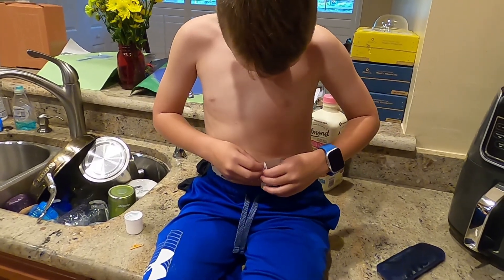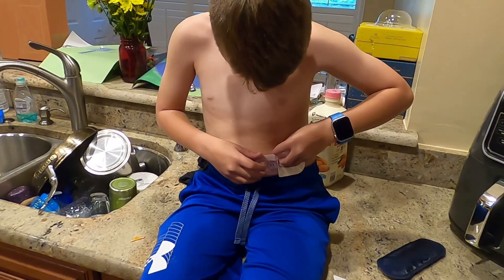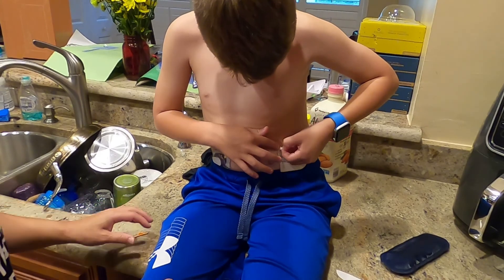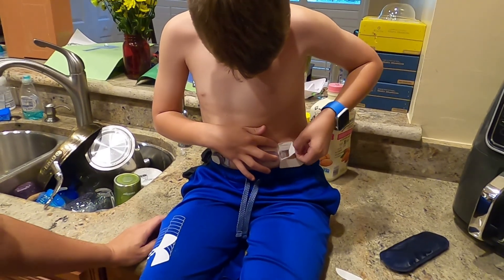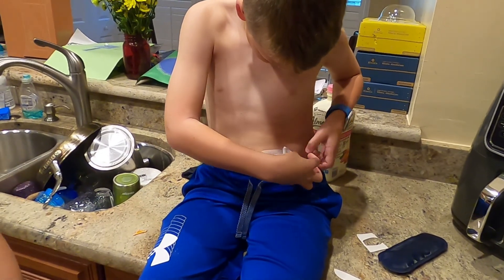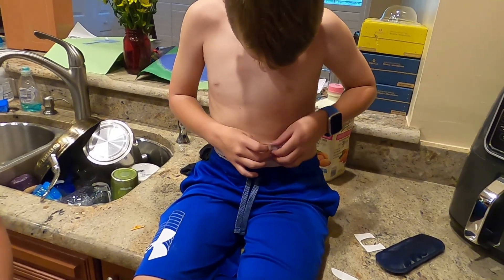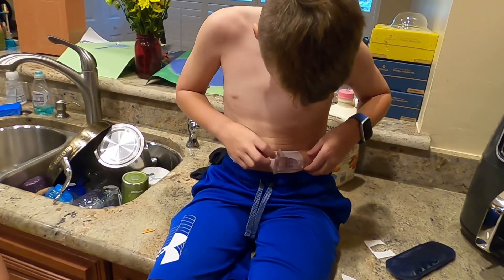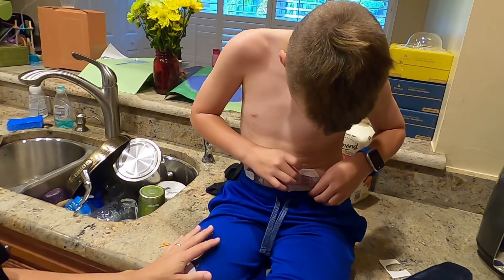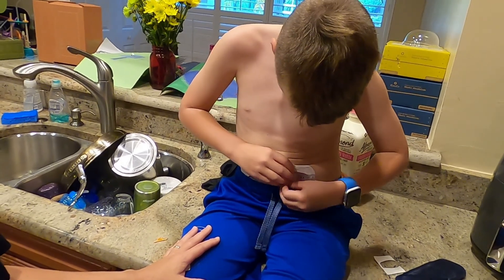There you go — you just kind of take it off. Take the middle off next. Just take it off section by section. I will say the one thing — the first time we did his sensor, it wasn't comfortable for him, so we took it off. Dexcom replaced it, no problem. And then we had him lean over so that he had a little extra skin, a little extra cushion, for this sensor that goes underneath his skin into the interstitial fluid. But we don't have a problem with that anymore.